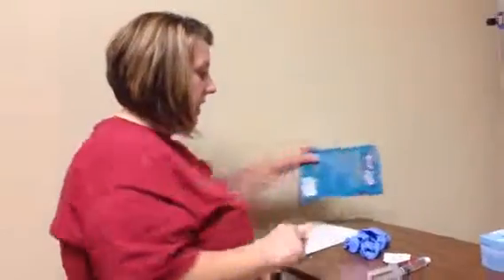Mr. Dunn, do you have any allergies? And he tells me he's allergic to codeine. Okay, I'm going to make sure we don't have any codeine. So I've verified his identity. I will go over and perform my hand hygiene.